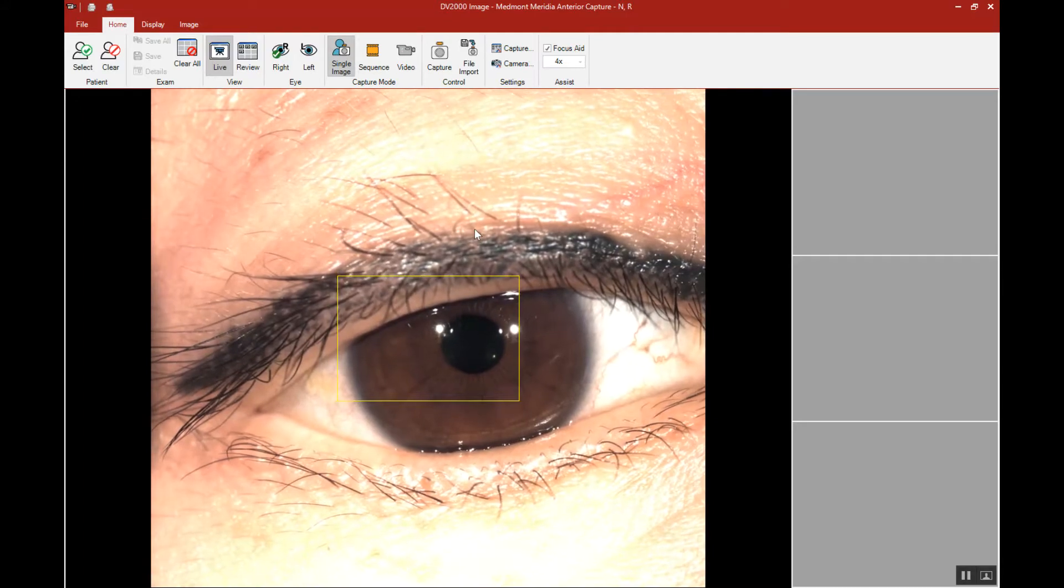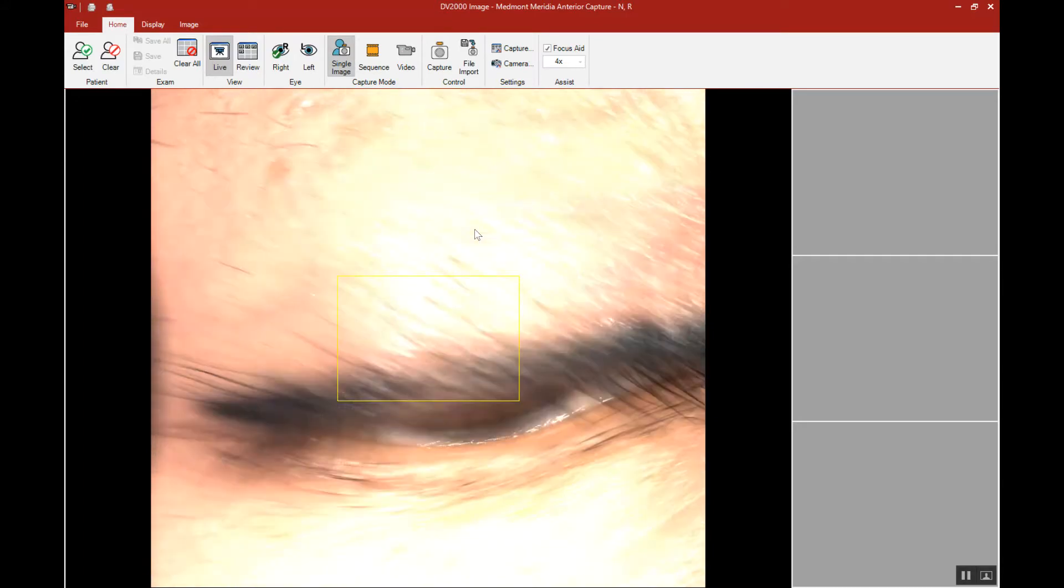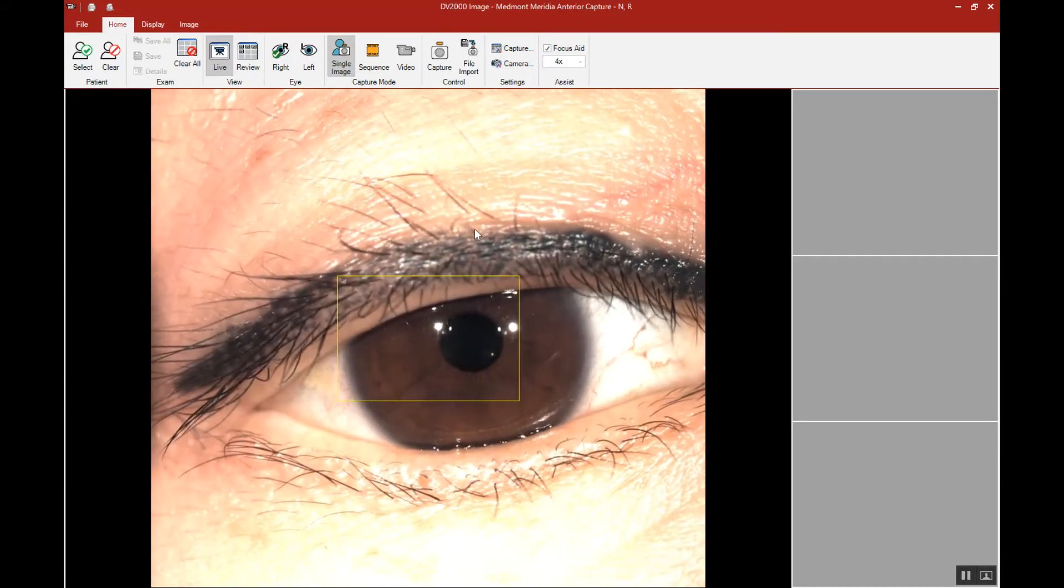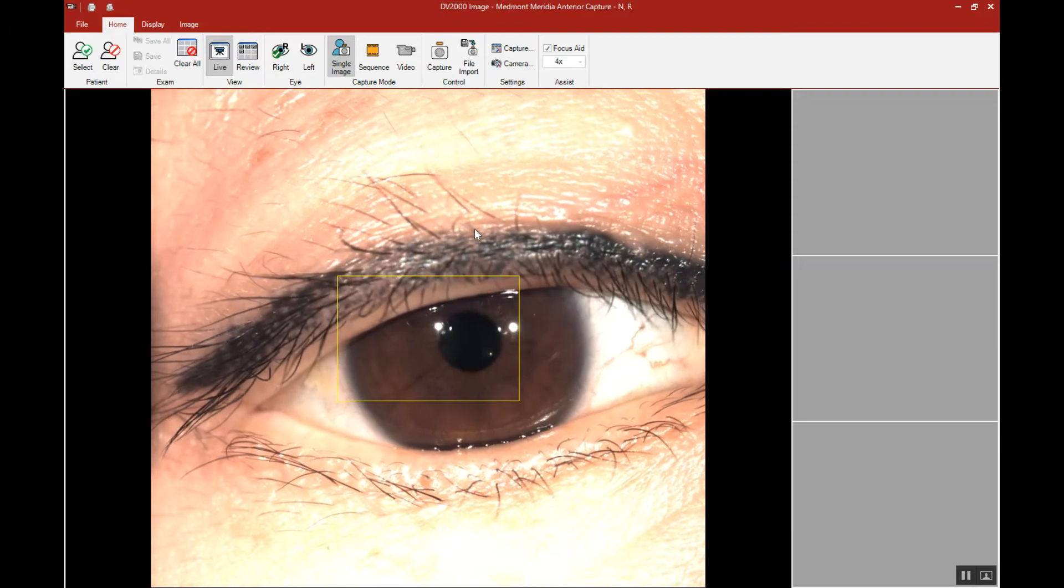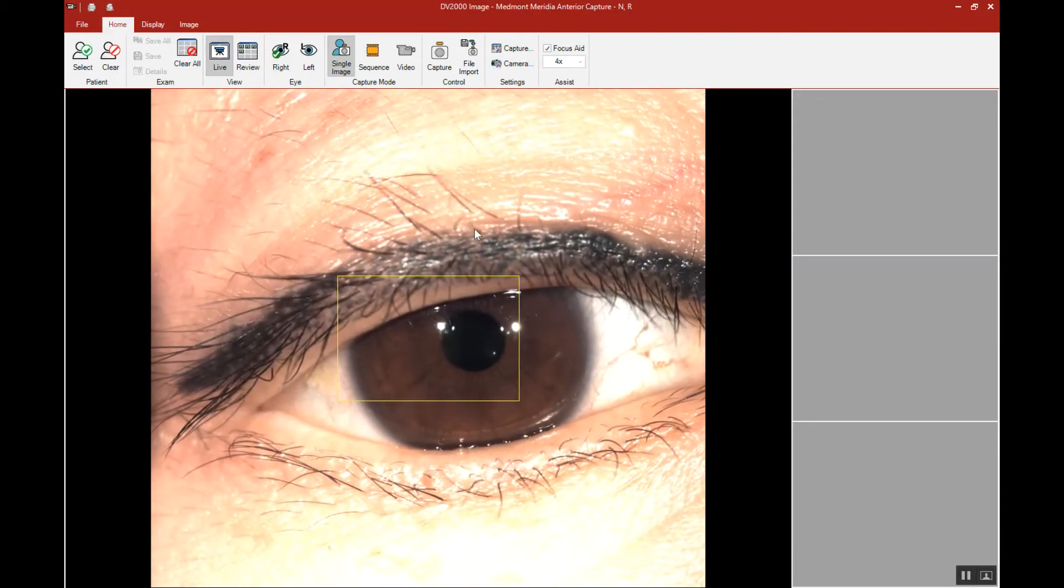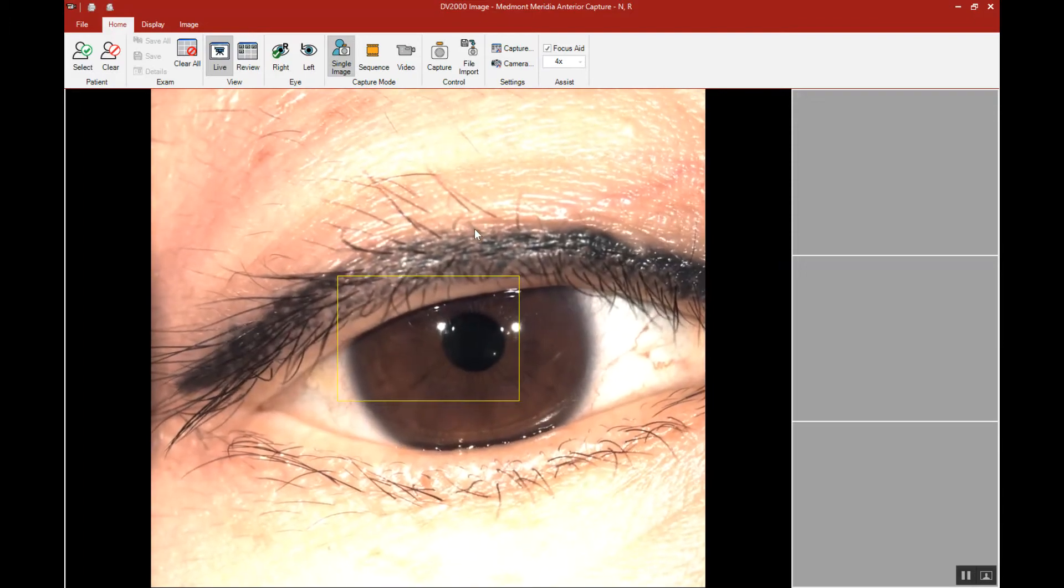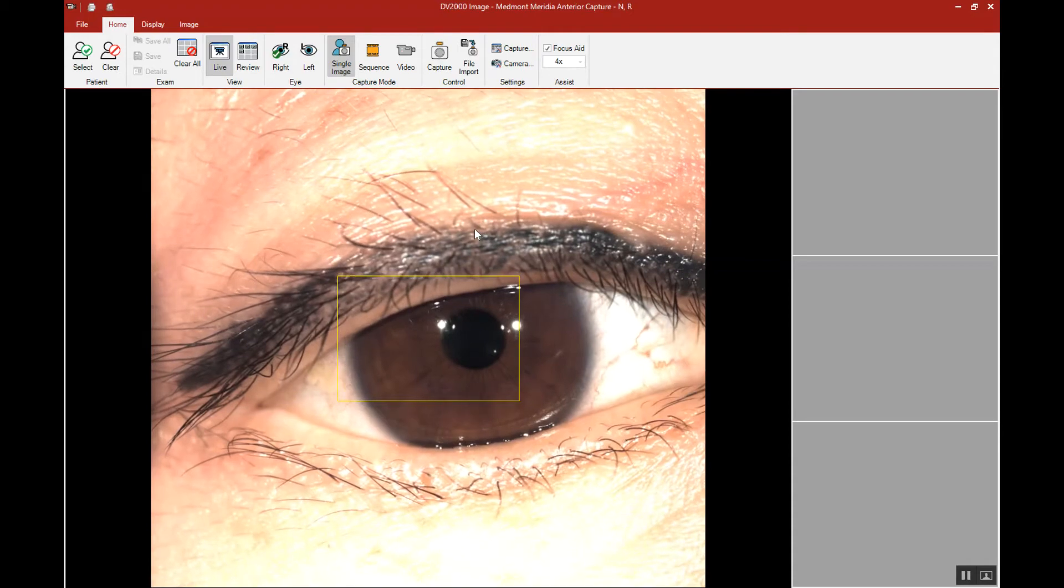for fluorescein capture, you may need to decrease the illumination for a scleral lens, or increase the illumination for a corneal GP, and the same for the meibography capture.